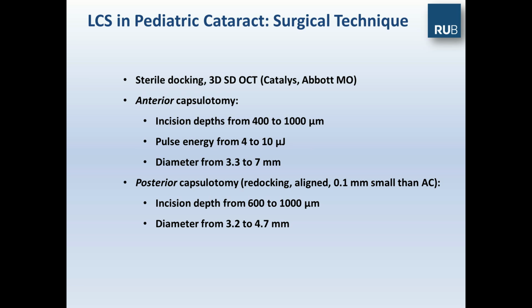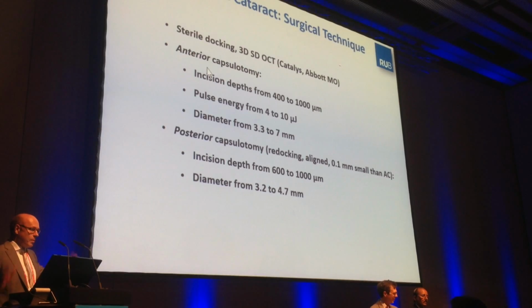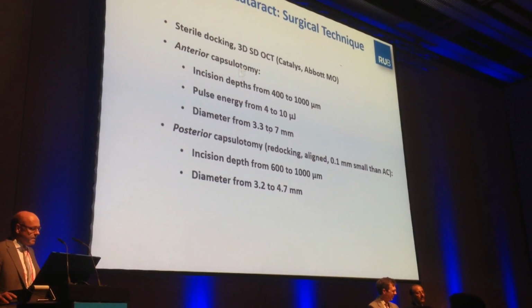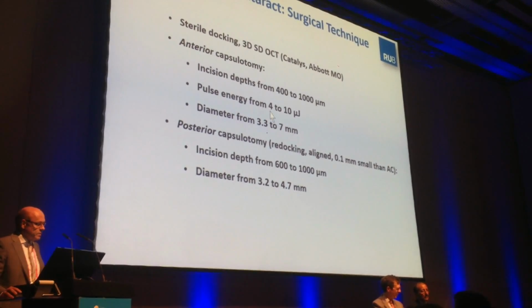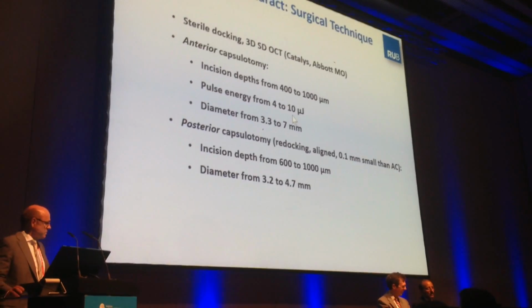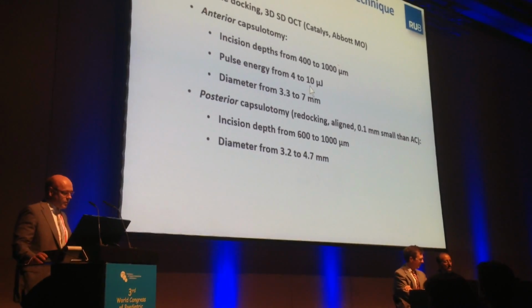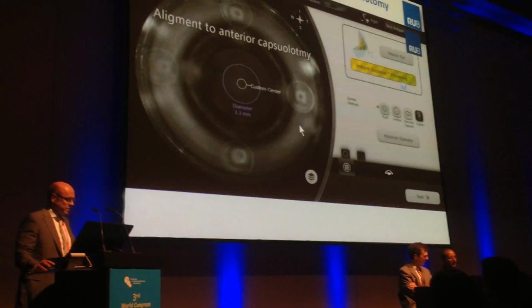And our settings here with this 3D SD-OCT, so it takes into account 3D, even if it's tilted or something like that, it compensates. The anterior capsulotomy with incision depths from 400 to 1000 microns, with pulse energy different because the capsules are sometimes very robust and others are not. And these are the settings for the posterior capsulotomy.